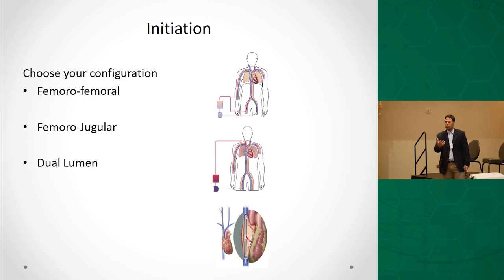Now, centers that are starting new, including the center that I have gone to, don't have a lot of experience doing Avalon catheters. In the last 6 months I've done 10-odd cases, and we've had almost 5 cases where the Avalon got into the RV. Here at UAB, 80% of the practice for VV ECMO is still Avalons, and since there's so much experience, these kinds of things are very rare. So it all depends on what you can do. Some of our folks who cannulate are not very comfortable, so we are doing a lot of fem-fem right now.